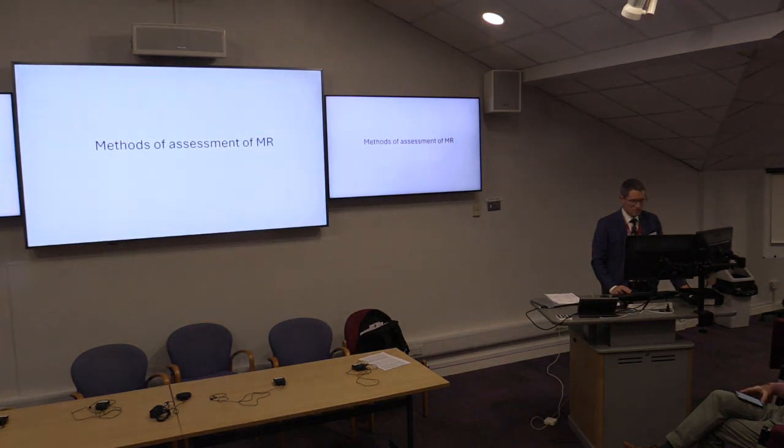So let's talk a little bit about assessing MR. So for me, when I think of assessing MR, I want to know 2 things: severity and mechanism. Okay?